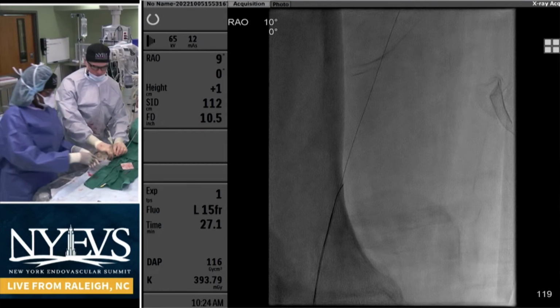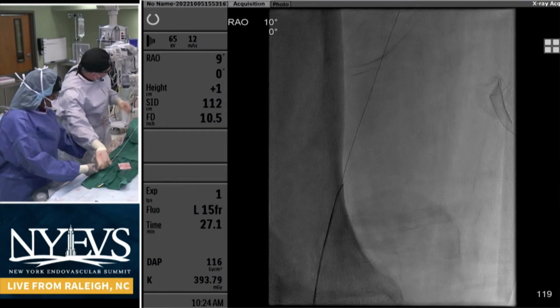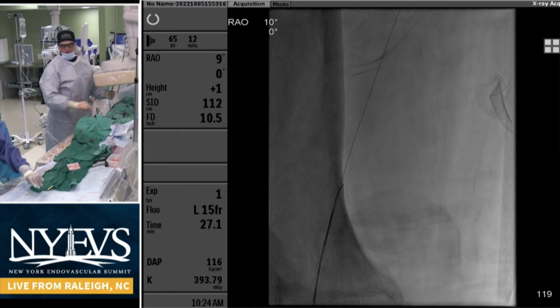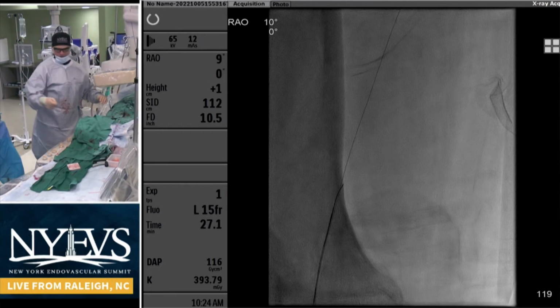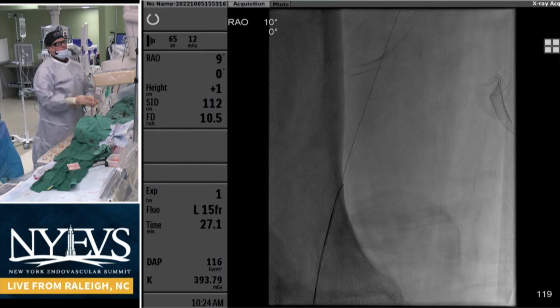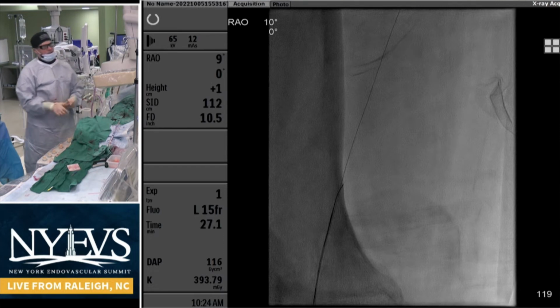Right. Okay, great. Dr. Genovese, any thought on the wires being close? I mean, an important point is to have multiple angulations and exactly on top of it. You're really close. You're not still connecting. Any of you, not thinking about the cost, talk about doing a re-entry somewhere? I mean, I think re-entry.